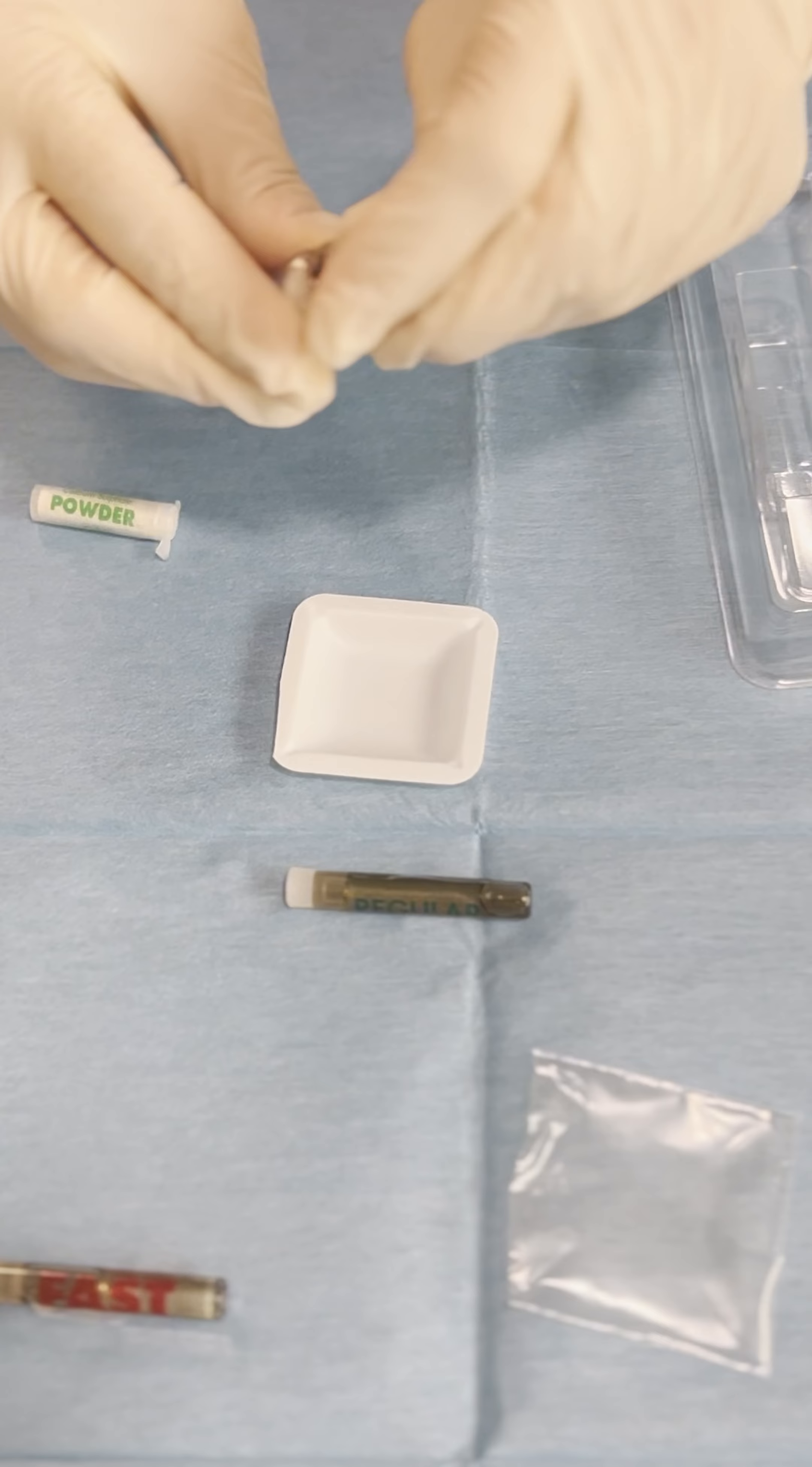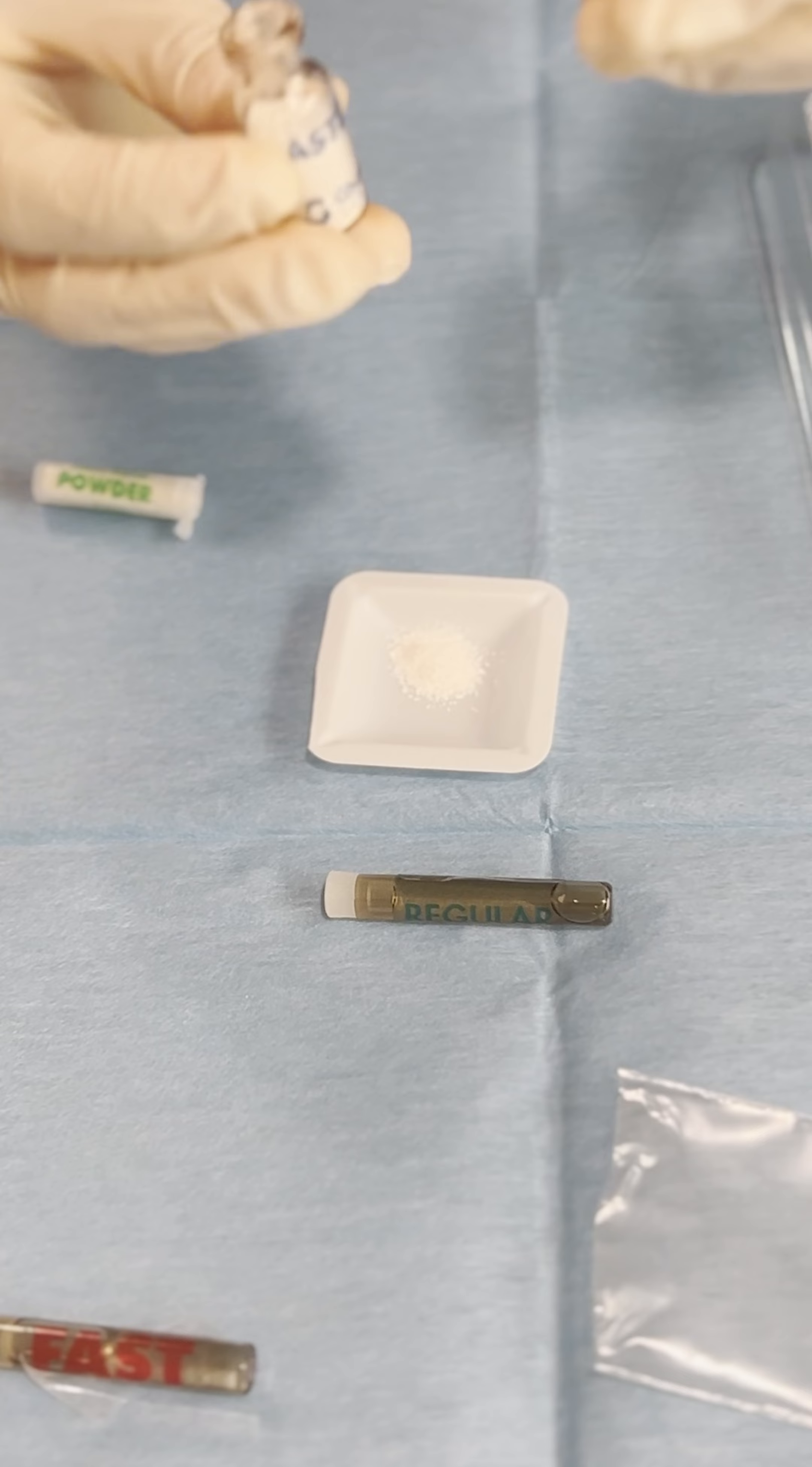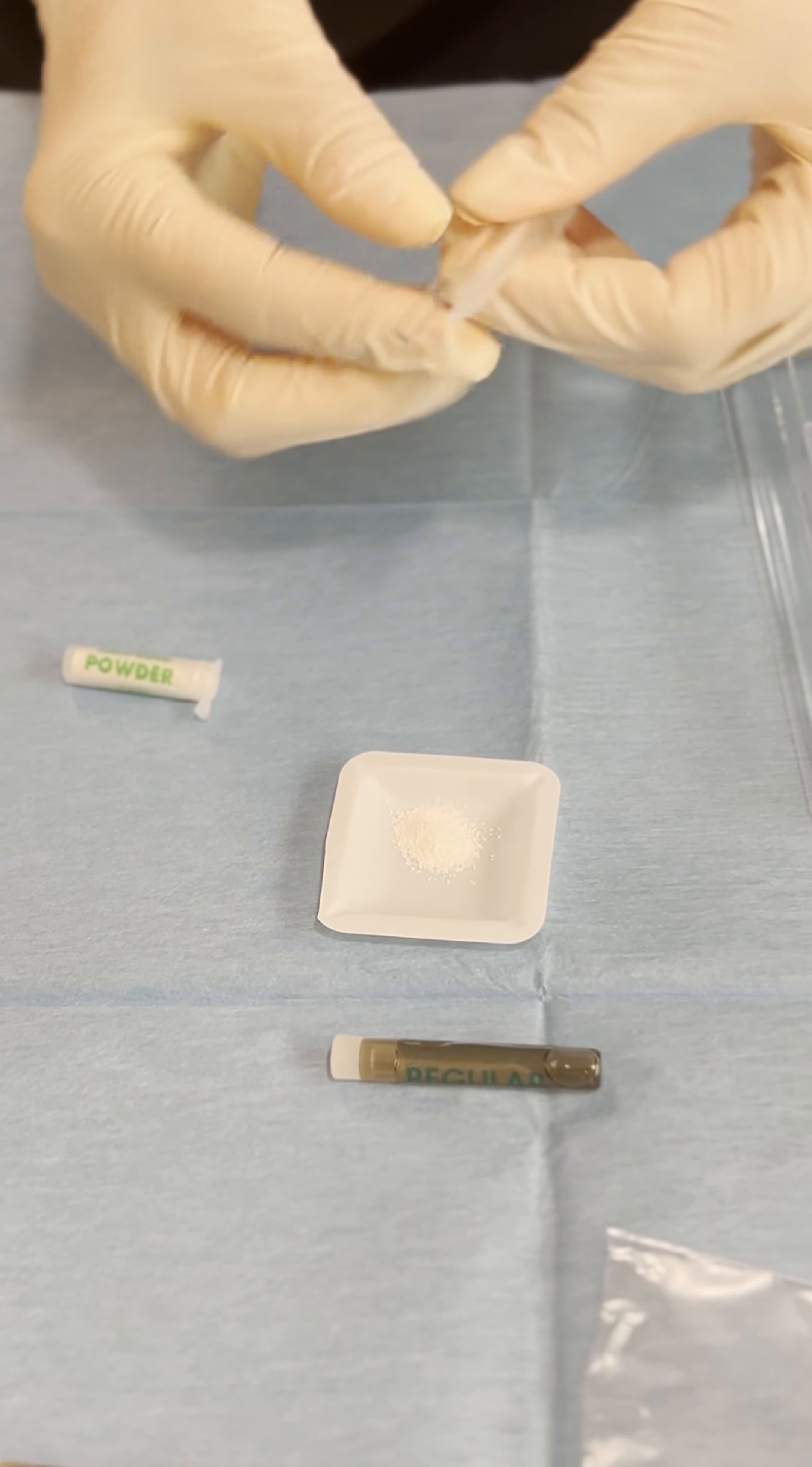We can pour the biomaterial directly as everything is sterile with a clean pair of gloves and we can pour just the right amount that we need. We can close this up, we can sterilize this, there is no problem and we can use it for other cases but we have to be very careful with touching it with the right gloves.